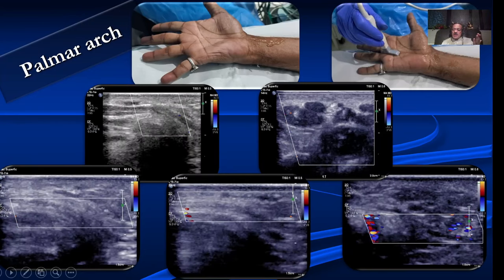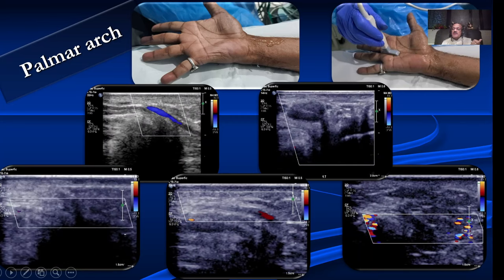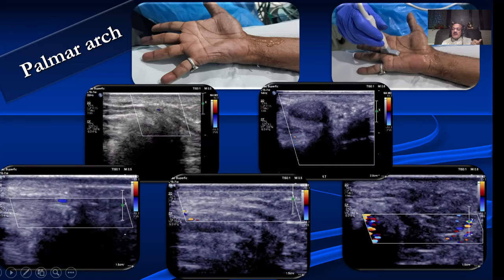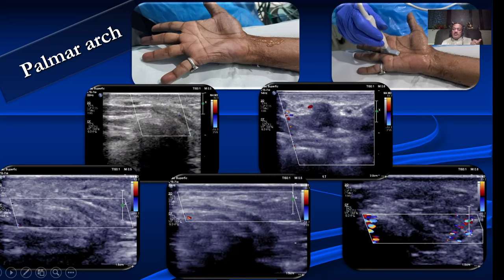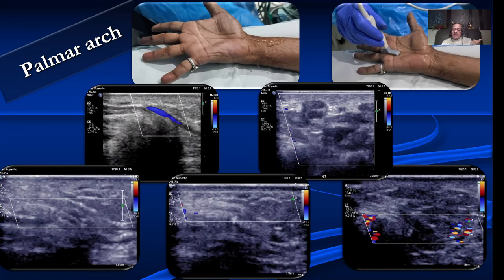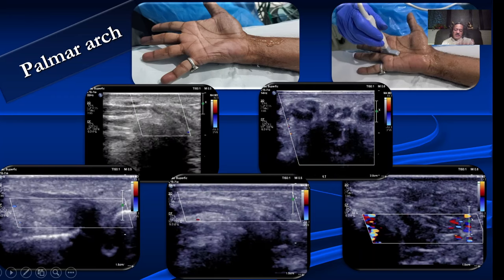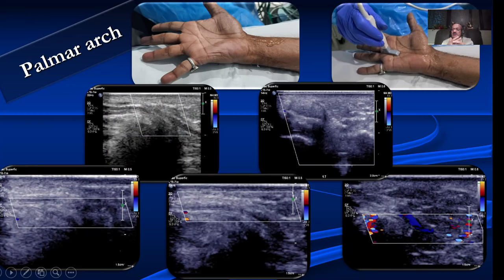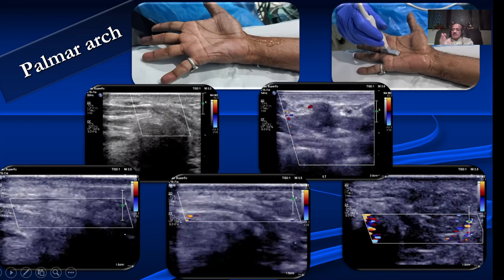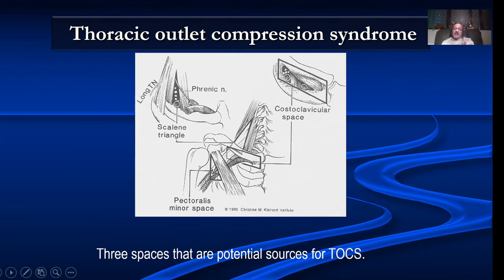We can also look at the palmar arch and the flow in the digital arteries. This is typically done when the patient is suspected to have small arterial disease — for example, if everything is fine up to the radial and ulnar arteries but the patient still has symptoms, that is when you start looking at small arteries in the palm or in the fingers.